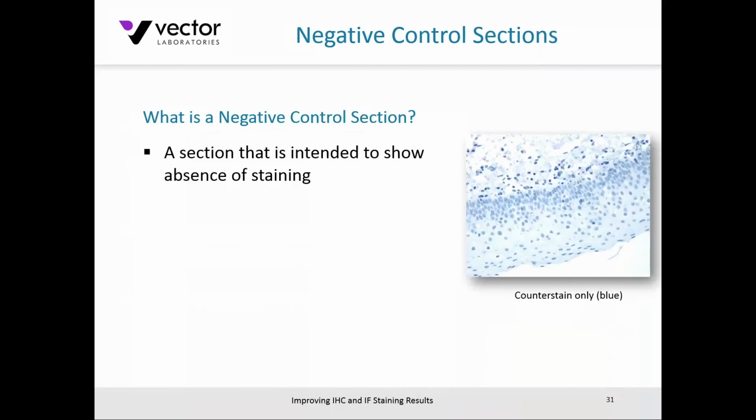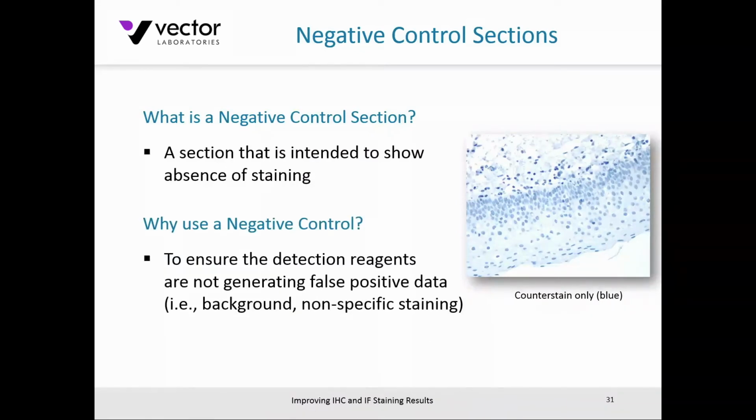Okay, let's move on quickly to negative control sections. Obviously, a negative control is a section that's intended to show an absence of staining. And I've sort of shown that over here with this stain, just showing a blue hematoxylin nuclear stain. But the reason for implementing a negative control in your assay is to ensure the detection reagents, which include the primary antibody, are not generating any false positive staining that you're going to then report as being where your specific target antigen is being expressed.